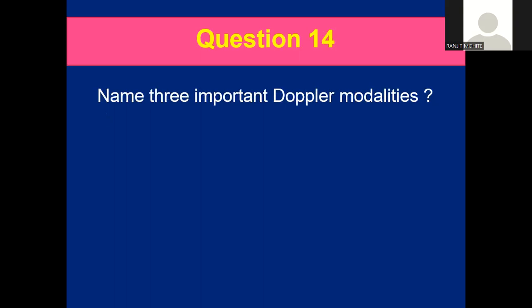Three important modalities of Doppler? Pulse wave Doppler, continuous wave Doppler, and tissue wave Doppler.